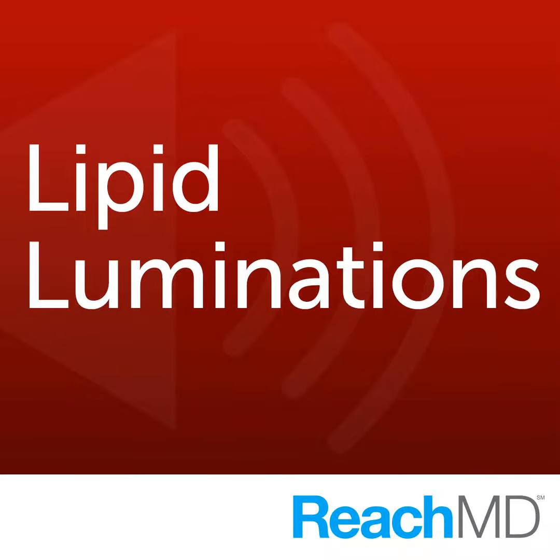It is a very controversial subject for a number of reasons. The first reason is it's not looking at the coronaries, right? So why should we be looking at carotid IMT? Why should we be looking at the carotid when what we really want to know is what's happening at the coronaries? So why aren't we imaging the coronaries? Well, the reason by ultrasound that we don't measure or image the coronaries is because they move, they're small, and can't be resolved by ultrasound.